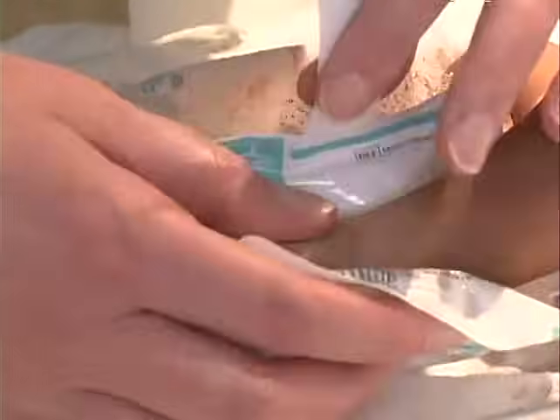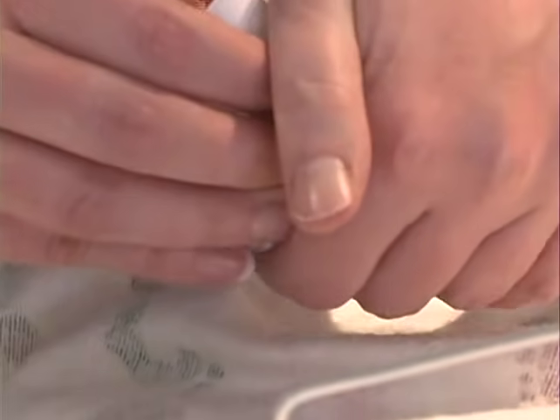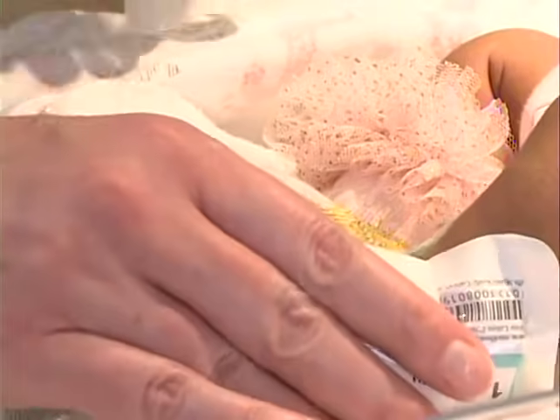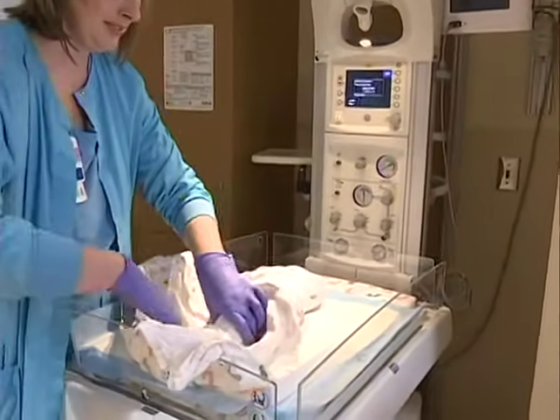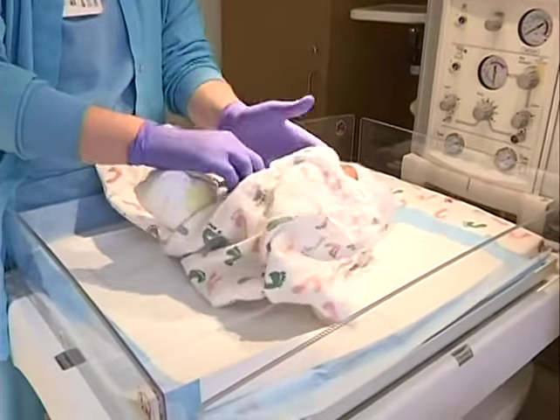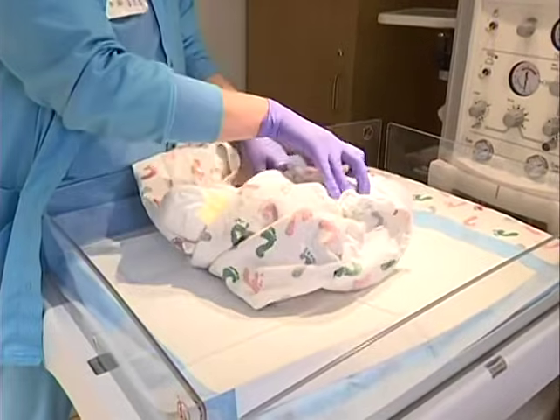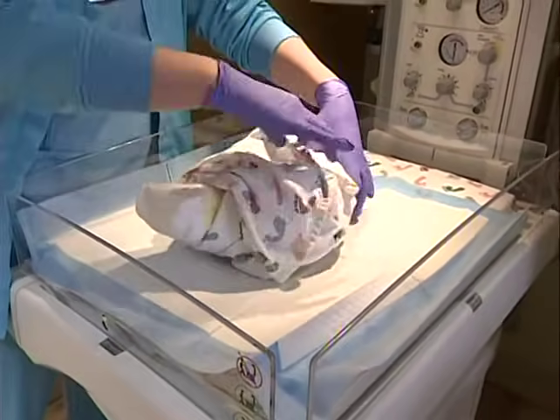Warm the foot for at least 3 to 5 minutes. Using a heel warmer and collecting the specimen right after the infant is fed may increase blood flow. Position the infant's leg lower than the heart to increase blood flow — you could elevate the head of the bed. You may also swaddle the infant to help keep them secure.